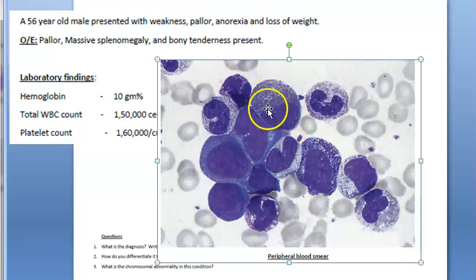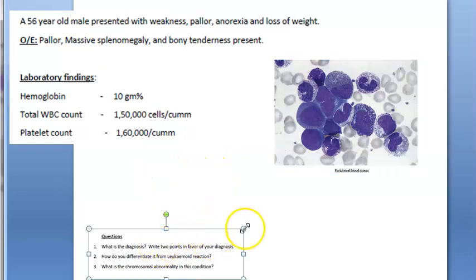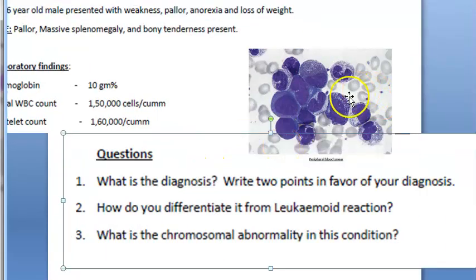Myelocytes are something like this. Actually, this looks like a metamyelocyte. It's a little bean shaped, the nucleus, right? Wherever it is bean shaped, you can say it is a metamyelocyte. This one is a myelocyte. Let us say this is a metamyelocyte, then promyelocyte, etc. So all these are myeloid precursors. Definitely these precursors should not be there in the blood. They all have poured over to the blood.